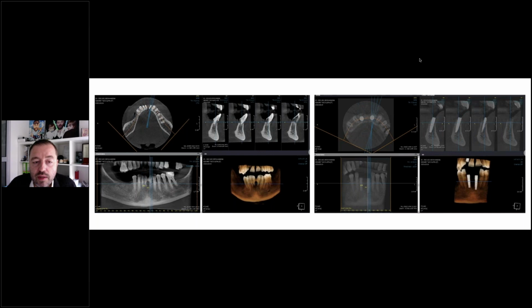incisor, and after, and now on the left incisor, and here you can see how it looks after the implant placement. It was a slight, let's say, level difference between the two implants because of the condition that we had, but with a matrix that we can create a direct connection regardless of the depth of the connection, it will be possible to compensate this.